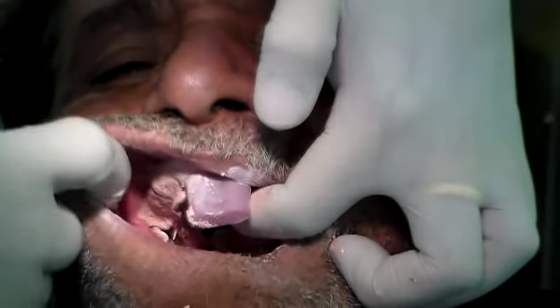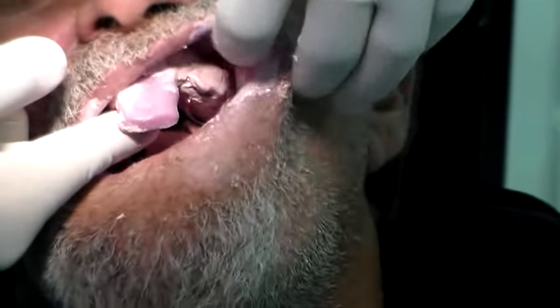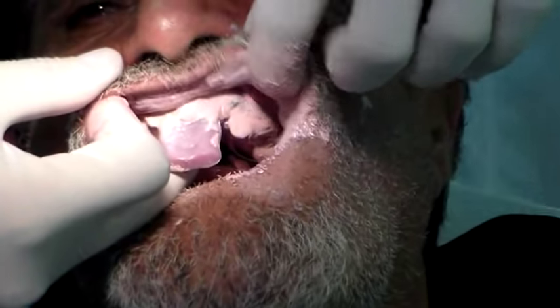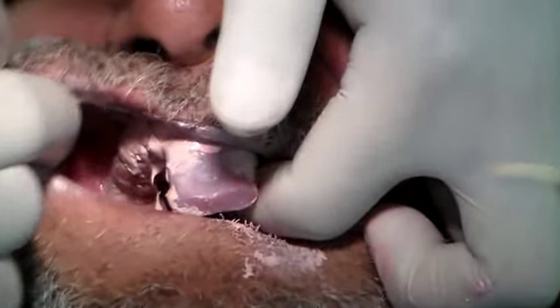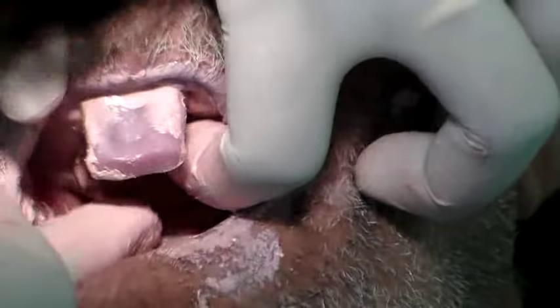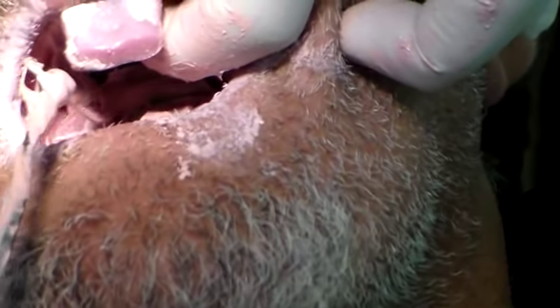Still soft. When you are doing the molding, you want to look inside the mouth to make sure you can see the green stick. You want to make sure you see the green stick, because your borders should be at the level of the green stick and not beyond it. I need to help my patient a bit — I am going to take my instrument and keep the pressure away, and just slowly take off some of the material.